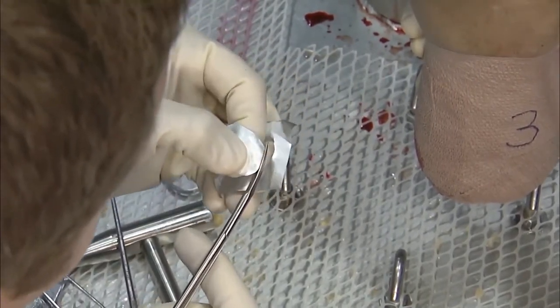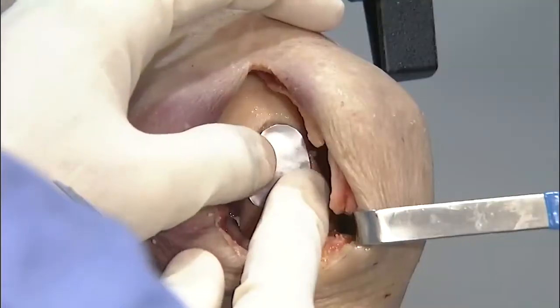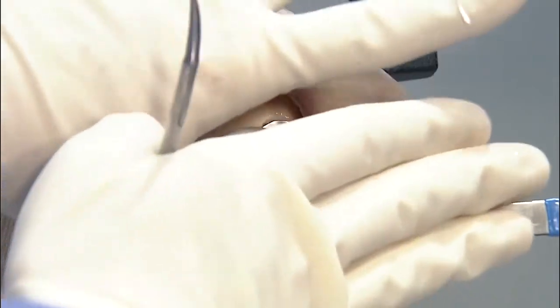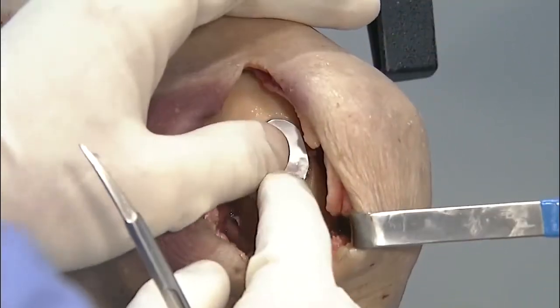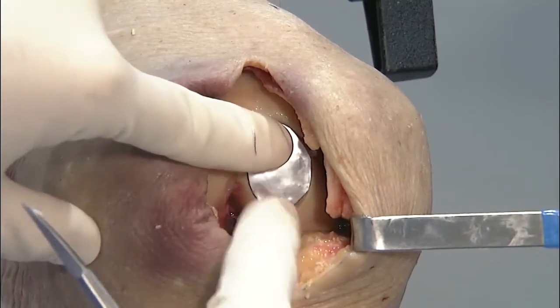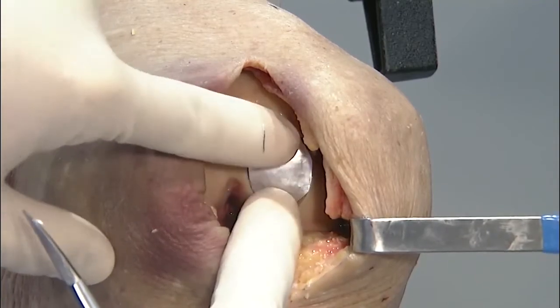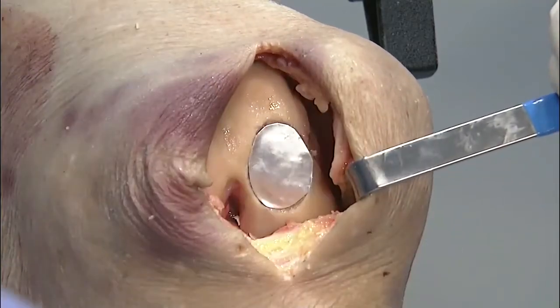Well, I try to bring it flush against the articular cartilage walls. So you don't want it overhanging. The implant itself, you can either have side to side with the cartilage. It's okay to come up a little bit on the wall of the articular cartilage. That can aid your horizontal integration, but you certainly don't want it overhanging because you worry about graft delamination.